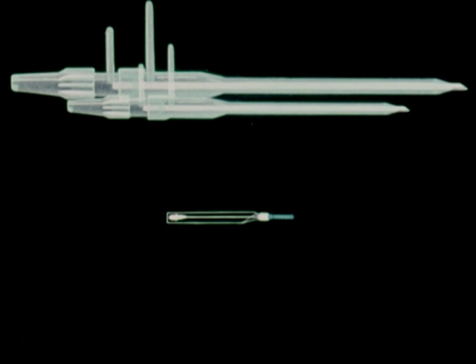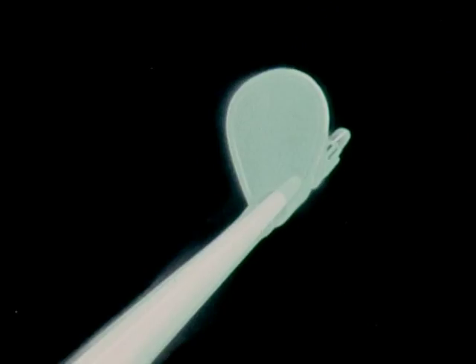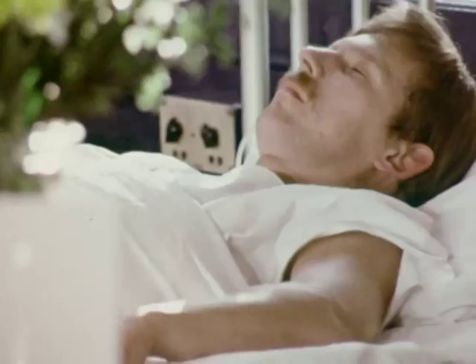The last preliminary stage is the choice of the appropriate intravenous device, a choice usually made between the catheter, the cannula, or the increasingly accepted winged needle. This is the cannula, a tapered plastic tube formed around a needle, which provides the method of entry.